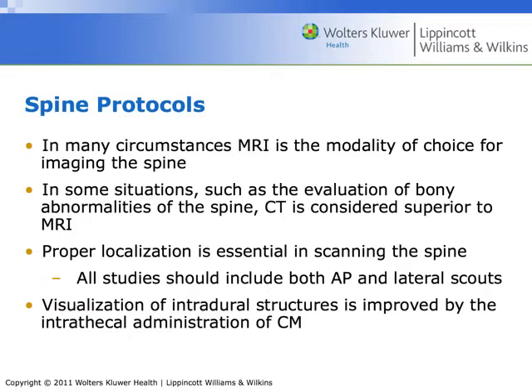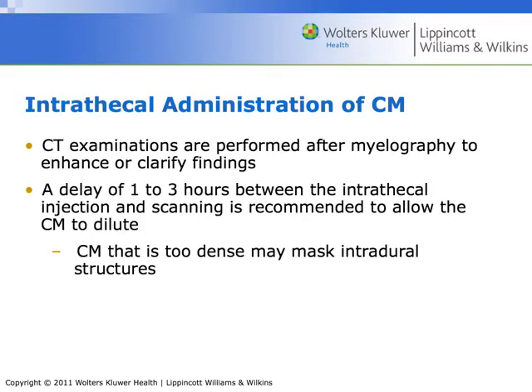And visualization of the intradural structures is improved by intrathecal administration of contrast. So if that's the case, then typically what we're talking about is, I'm sorry, I just drew a blank on the procedure, but they're going to do a fluoro procedure prior to it, where they introduce contrast to the intrathecal sac, and then we'll come over and do the actual CT of their lumbar spine or whatever. That's if we just need to see the C-spine or the L-spine or something like that. But generally those patients are going to get referred to MRI unless they've got a pacemaker or something like that.